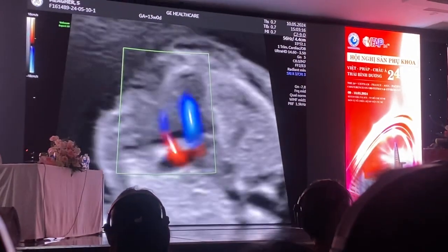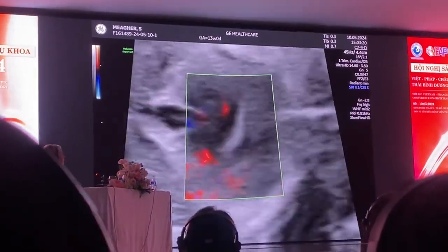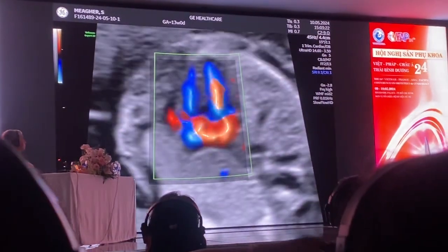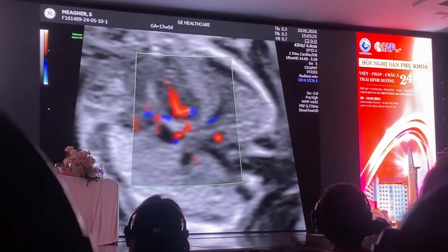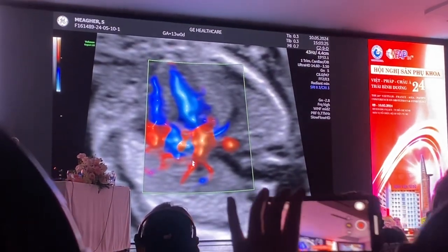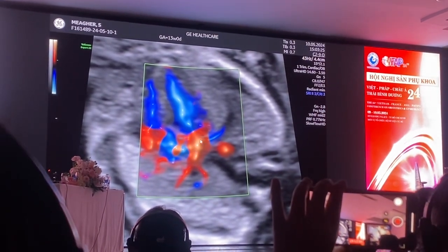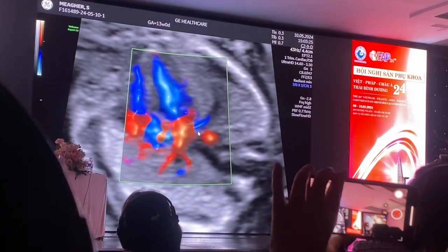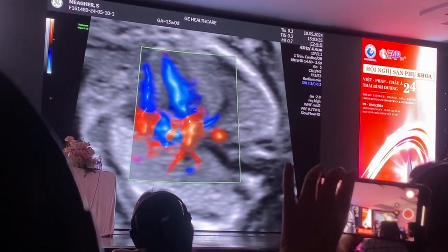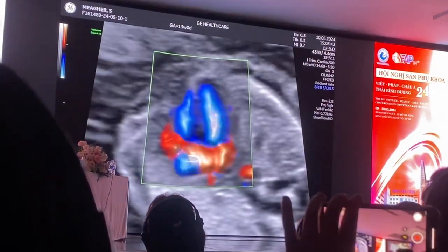Once I get the baby back in this 4 chamber, I need to look at the pulmonary veins, and this is where I go to slow flow technology. So I want to see if there are normal pulmonary veins. If I just freeze in that image there, I catch the pulmonary vein, so this is heading towards the heart. This is the pulmonary veins coming in and draining the left atrium, and this is the pulmonary vein in blue, which is going the correct direction for us to be seeing pulmonary veins entering the left atrium. So I say that as a cine loop.